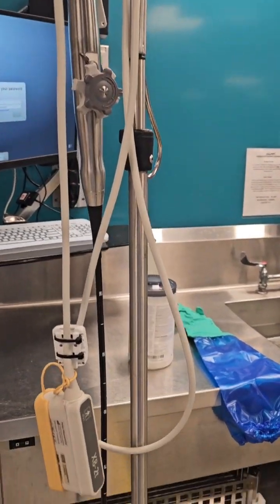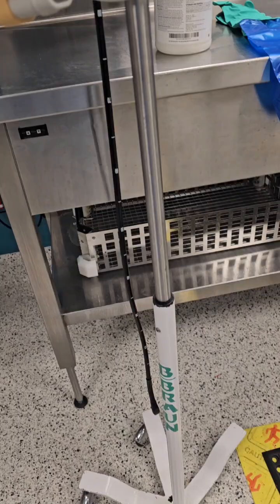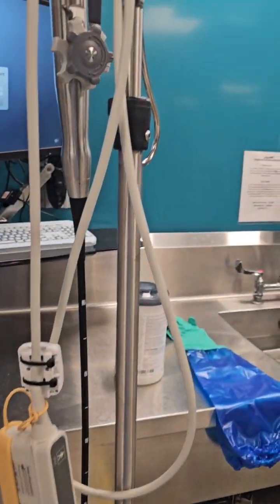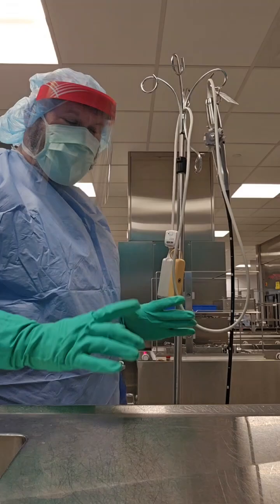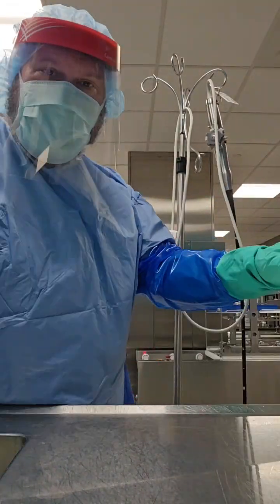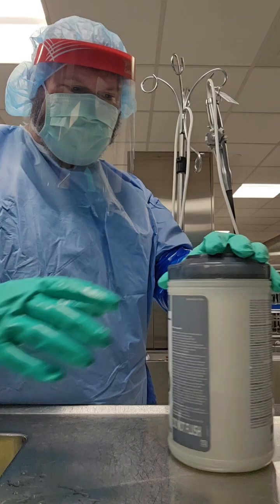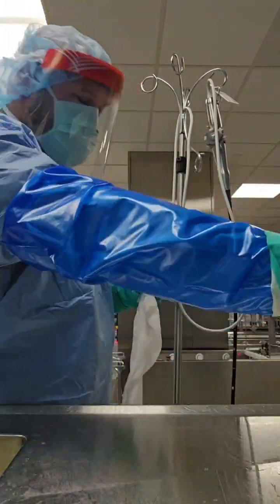Hey guys, welcome back to WDYD CSP — What Do You Do as a Central Sterile Processor. I'm going to show you how to process a TE probe in decontamination using two different methods that are approved by the IFU of the device. One involves disinfectant wipes and an enzymatic, and the other uses just straight enzymatic.